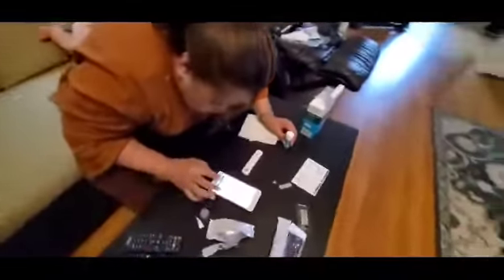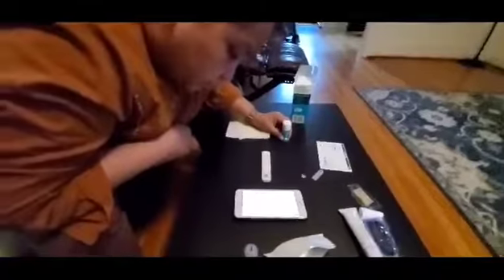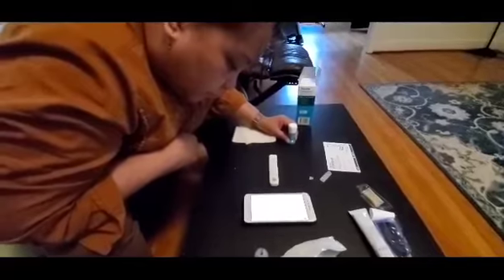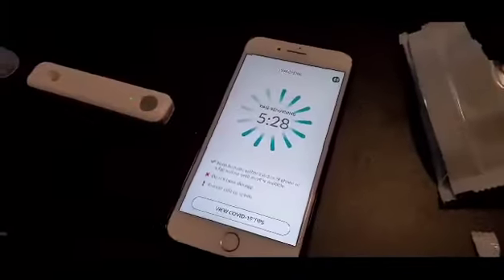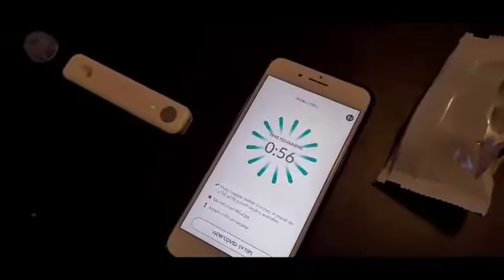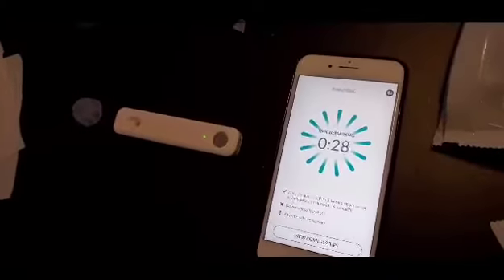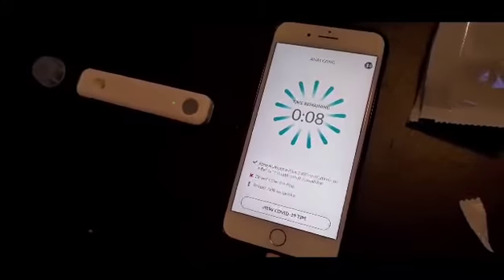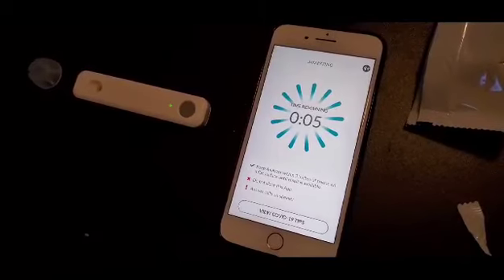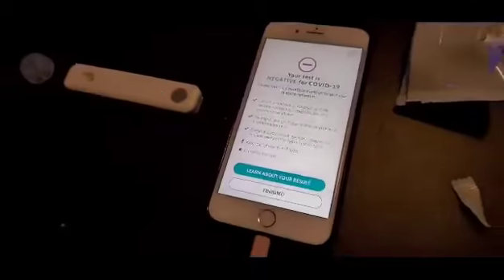Run test. Keep the analyzer within three inches of the phone and surface until result is available — do not close this up. Four, three, two, one — negative! Yes, thank you Lord!